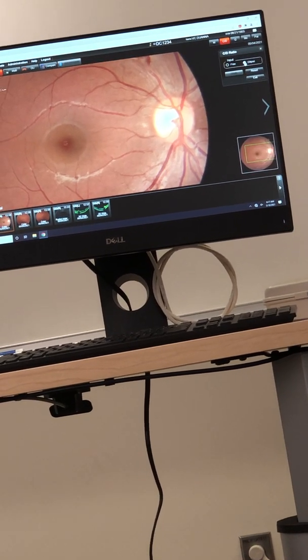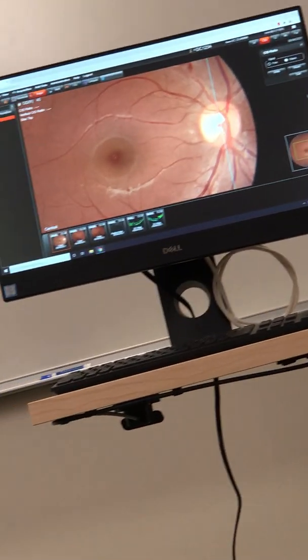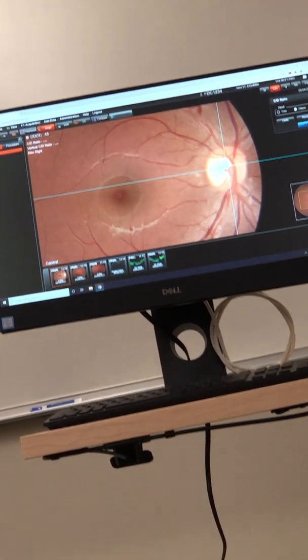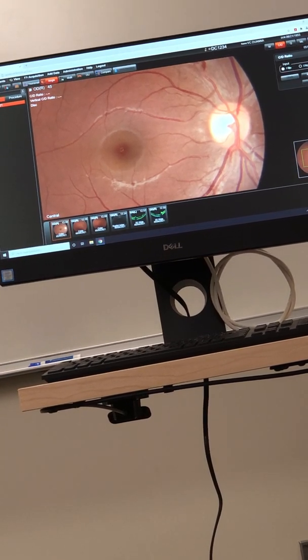Let's do ellipse here. Does it also spit out a diagnosis for the doctor? No, that'd be kinda nice, right? Smart machine, huh?